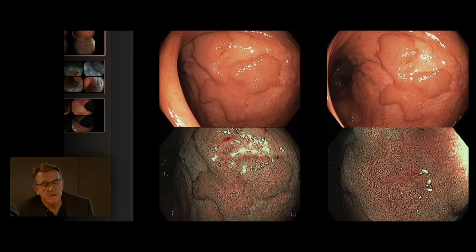And then when we look with the near focus mode, you can see the pit and microvascular pattern very clearly, and this little crevice here is a biopsy site. So that can create confusion, but the referrer would have taken a biopsy from there. And so sometimes you get that appearance. I mean, there's nothing here. Everything leading into that little absence is regular. So that's a biopsy site.